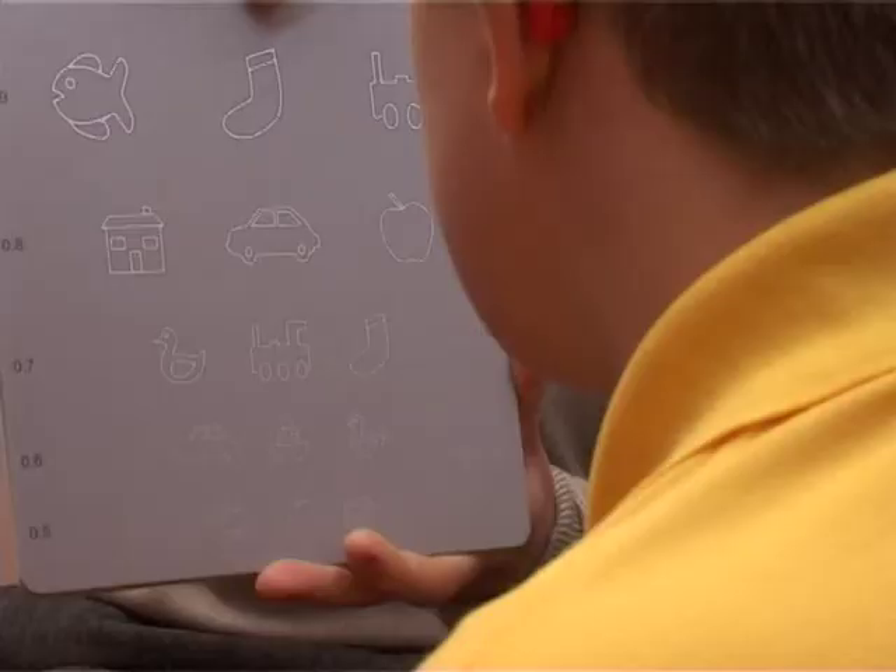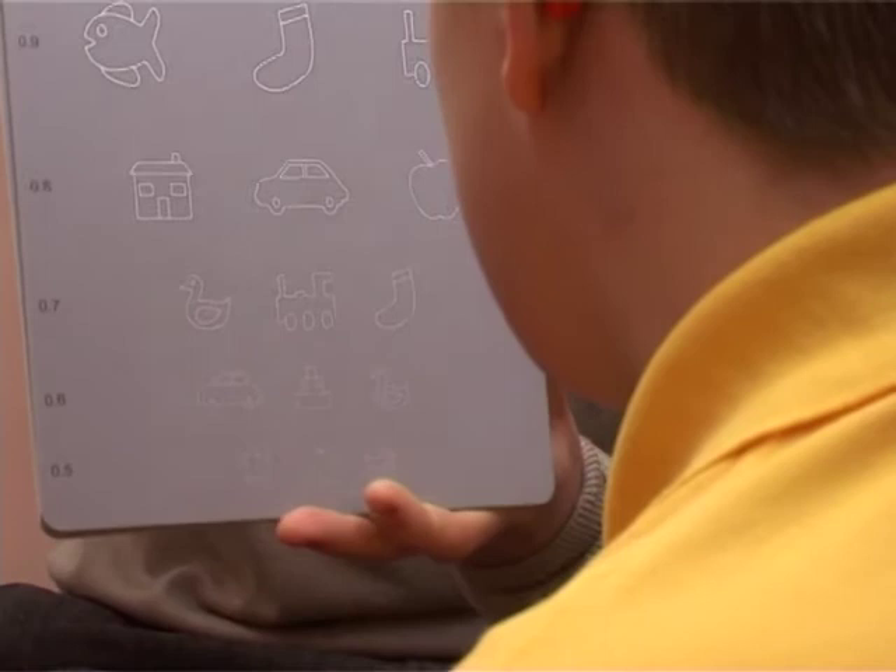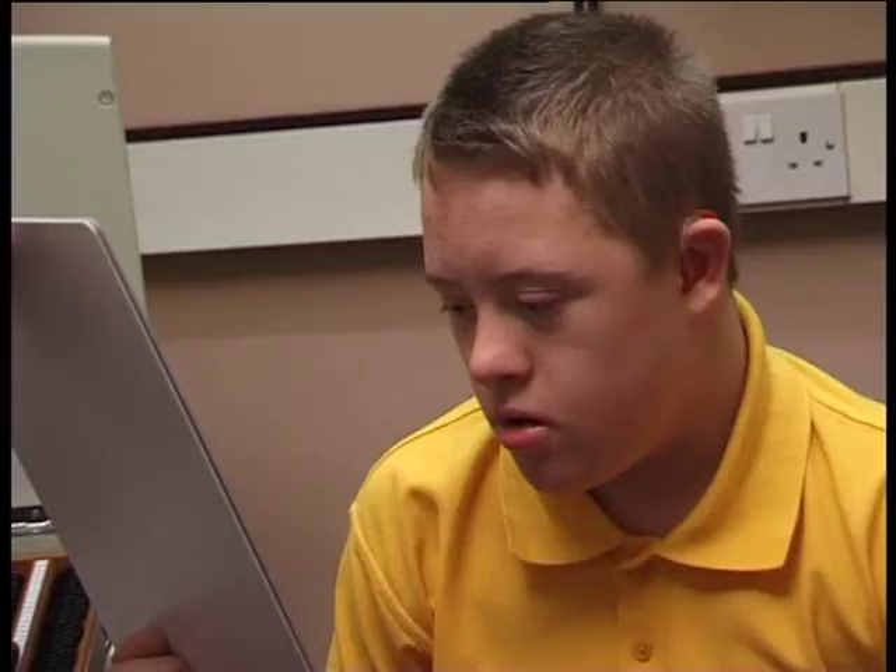Then we can ask the child to do the same for the test card, and record the finest pictures that they can name correctly.